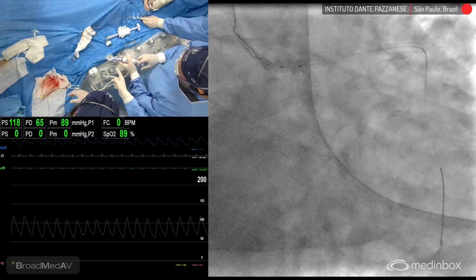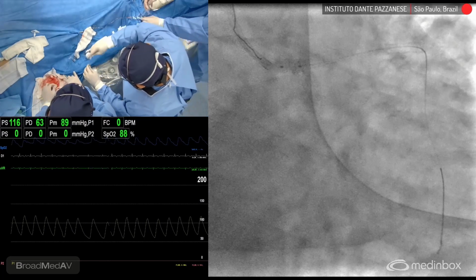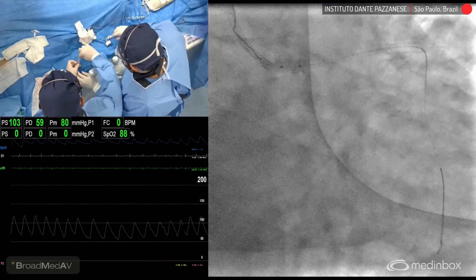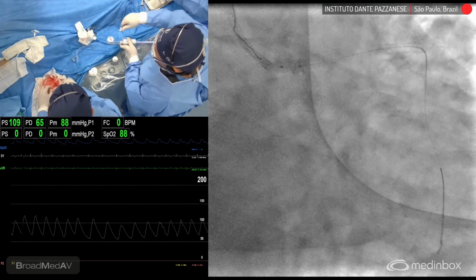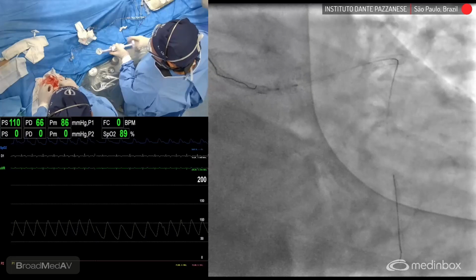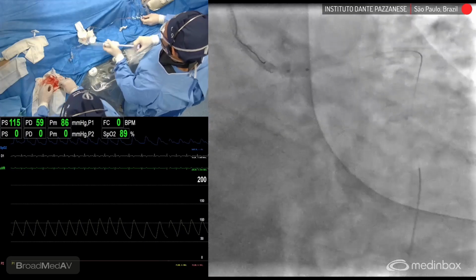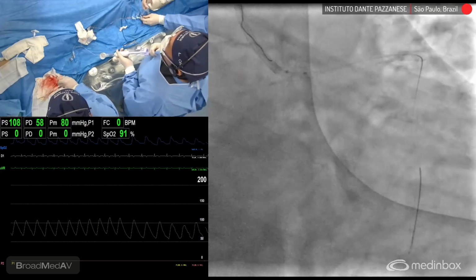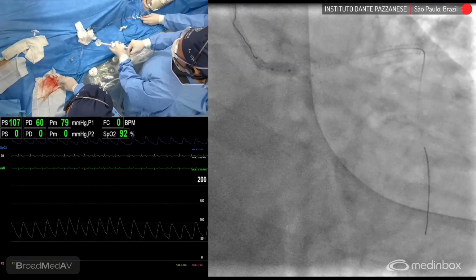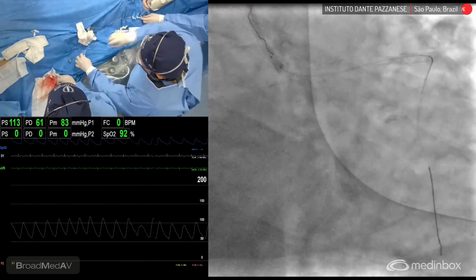Okay, high pressure as well. Can you show here? Okay, so 20, up to 27. Deflate. Then you're going to bring it to the ostium, right, Rodolfo? At the carina, you can see exactly where you are. High pressure as well. And now just to do the flaring here at the ostium. Okay, also high pressure. Okay, down.